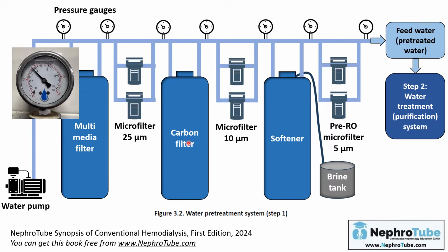But the international references mention that if the difference between the two pressure monitors is about 10 psi, which is about 0.68 bar, you have to take an action as backwash or changing the filter. So the references here in Egypt may be different than some of the mentioned references. By the way, PSI is the abbreviation of pound per square inch.